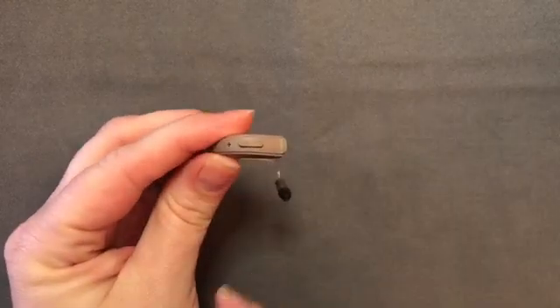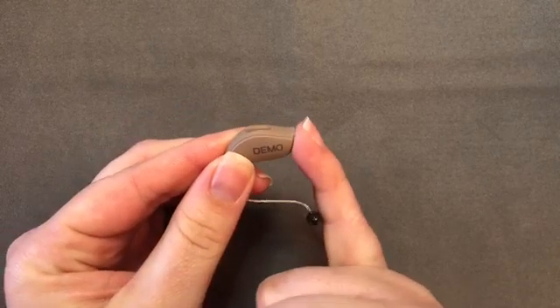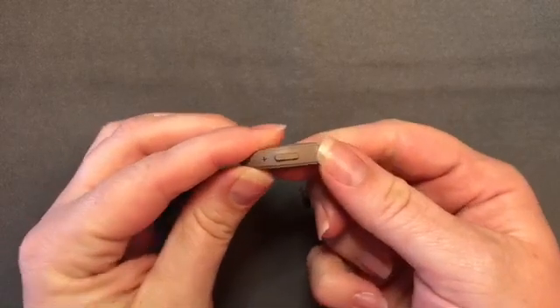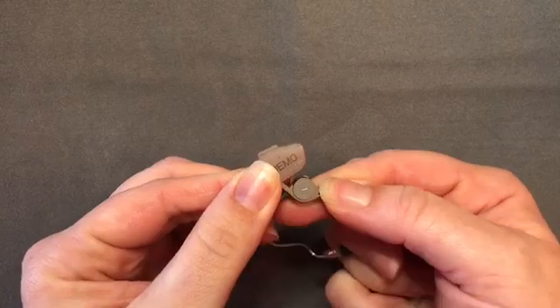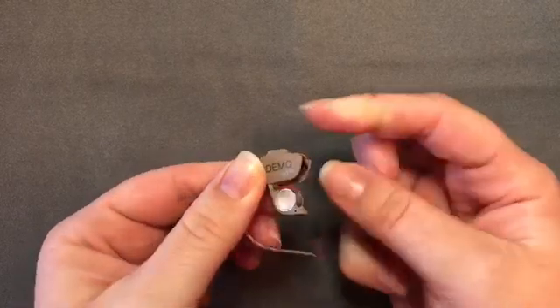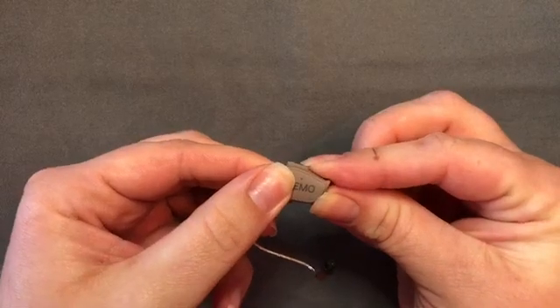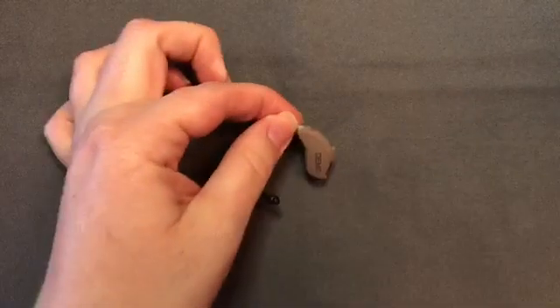Down on the bottom or belly of the device there is the battery door. There's a notch there that you can open with your finger or fingernail, and the battery sits in the door itself. It acts like a little cup and your battery contacts are on the inside of the body of the device. Anytime that battery door is closed, the device is on. If it's open, the device is turned off.